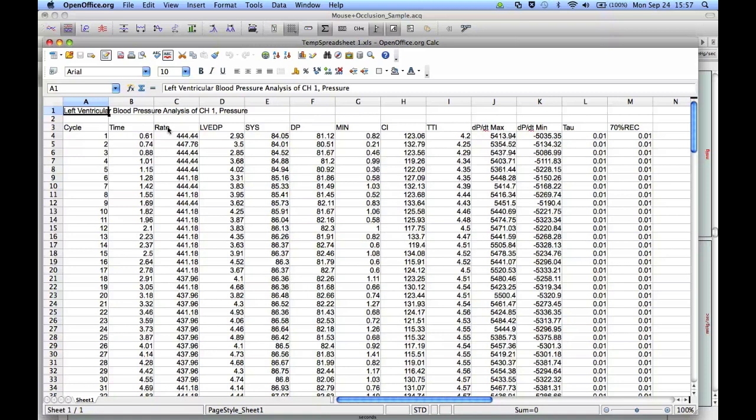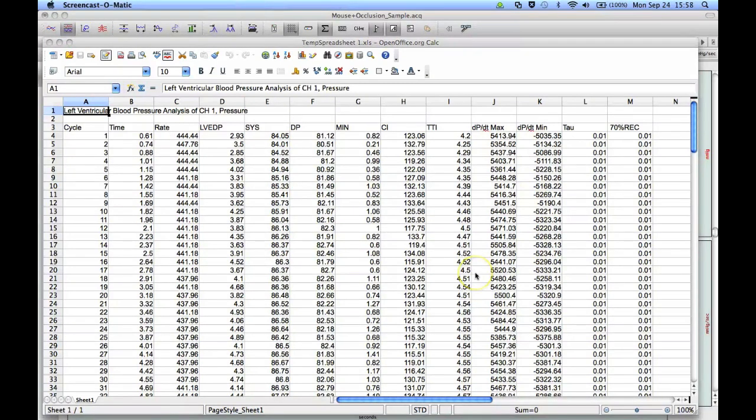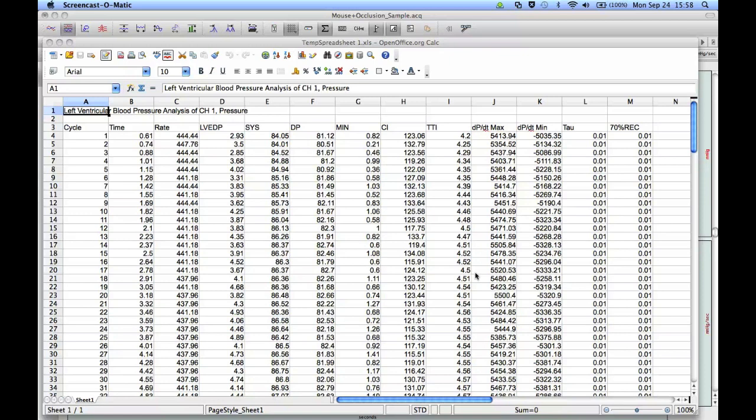developed pressure, minimum pressure, contractility index, tension time index, DPDT max and DPDT min, tau, and then your recovery percentage. And in the example we just ran through, I used 70%.